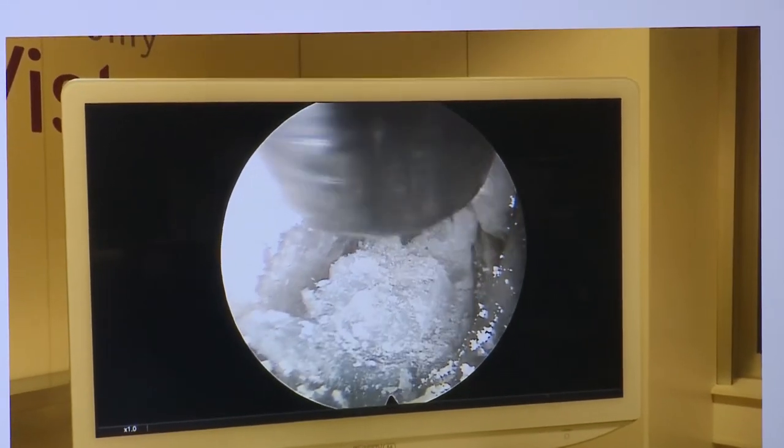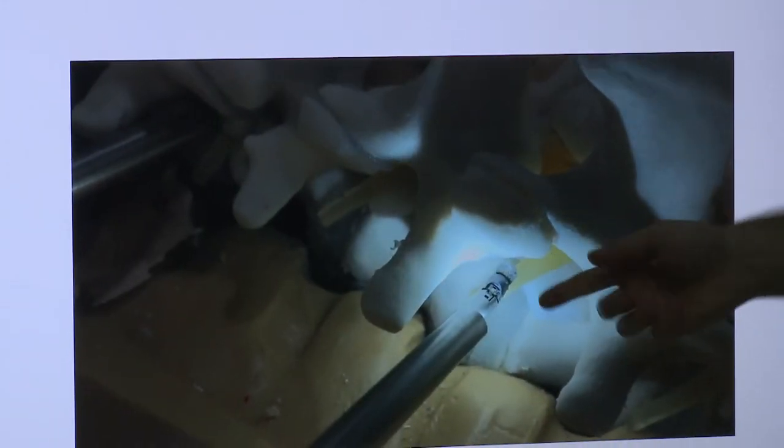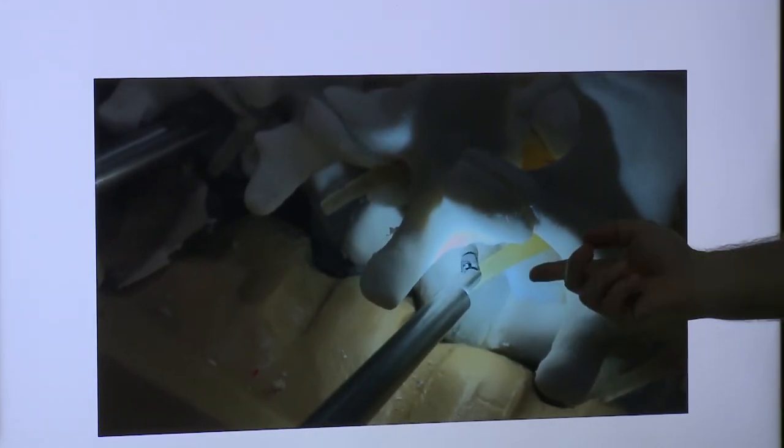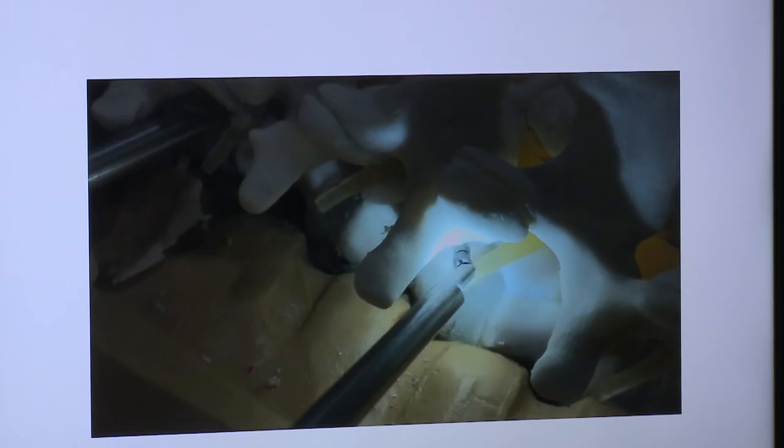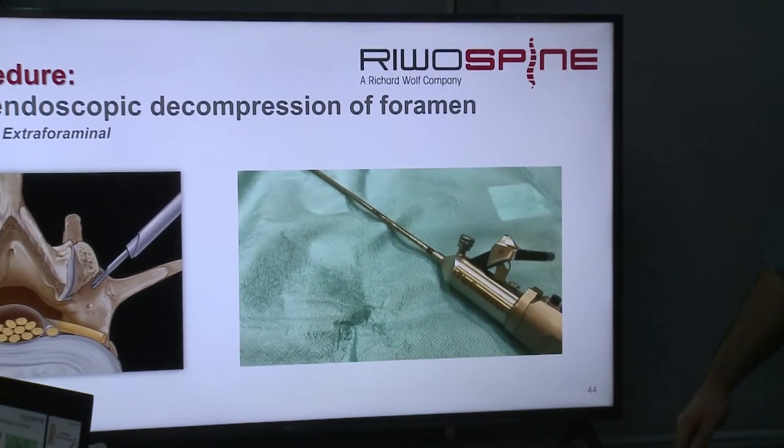You don't need to change the direction of the optic. Just press it and rotate. You see? You need experience to do that. Yeah, it's of course safe.